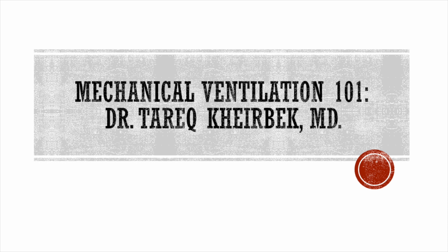Okay, so let's talk about the converse scenario where the patient's pH is adequate but they are hypoxic with a PaO2 of 52 on a current FiO2 setting of 80% on the ventilator. Now we have a patient with hypoxic respiratory failure, and the first step is also trying to find the cause of this hypoxic respiratory failure and trying to address it. But at the same time, we want to make sure that the patient is oxygenating well.